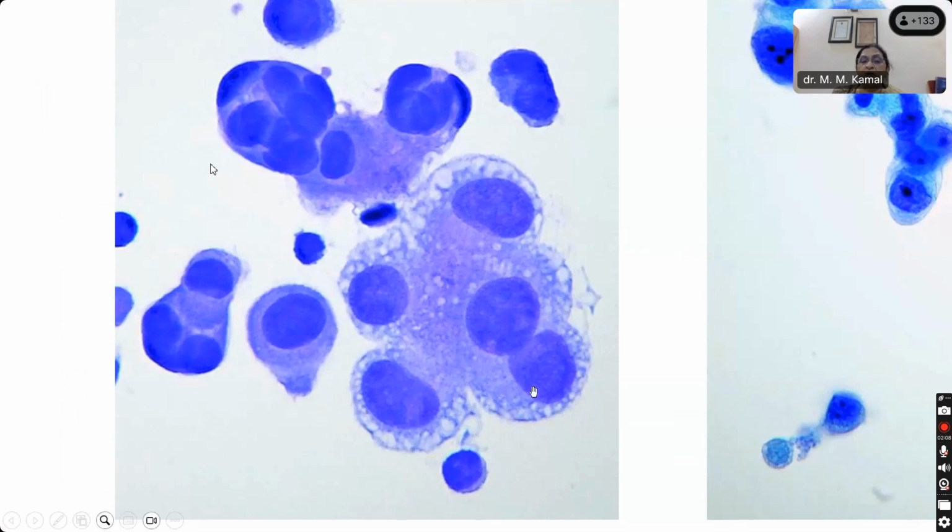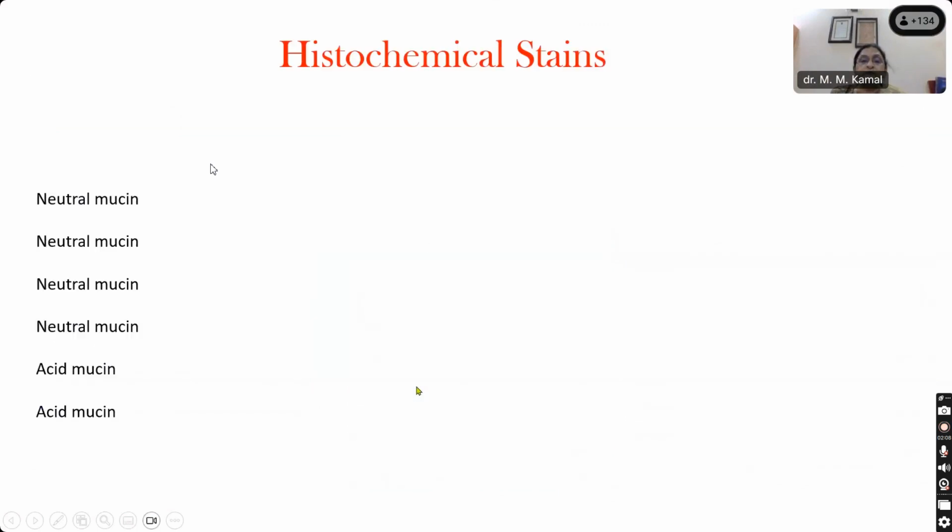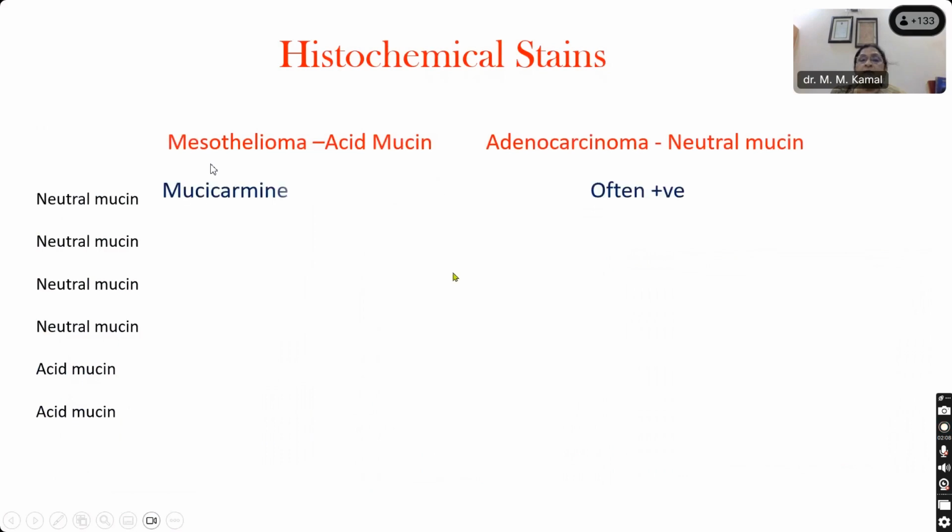So that is a feature of malignant cells. All these cells may look highly abnormal with high NC ratio and all other features, but still you can get this frilling and vacuolation even in malignant cells. But this type of feature is very specific for malignant cells, when you get the nucleus touching the periphery of the cytoplasm. So here now would you like to call it benign or malignant? Malignant, ma'am, because of those clusters or balls with nucleus pushed. Here in this you have, again, they are resembling the family of mesothelial cells, but I would put it as suspicious for malignancy.